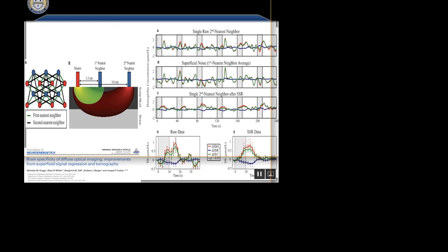They made their own accelerometers and they just put that on the tab. And that will be something in the next generation one that's already built into it. But that's to know the head motion and quantify it. But for the time being, it's not that difficult to do something like that.